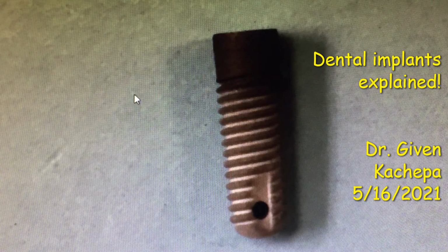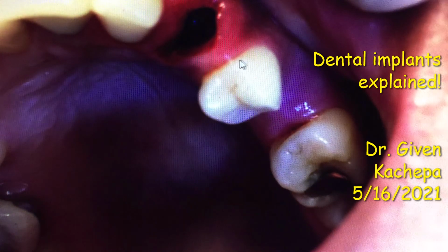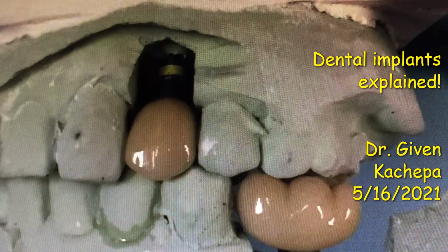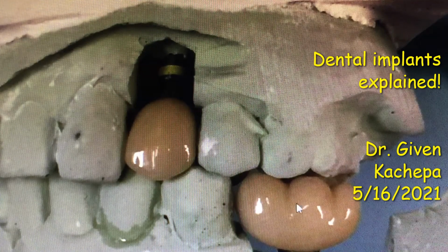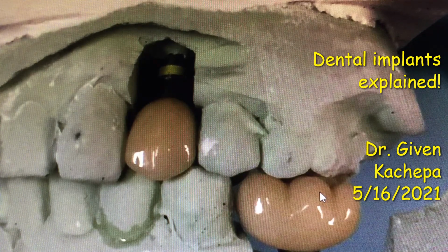So anyways, dental implants are just prostheses like this that we put in osteotomies like that there. And the patient comes back later and we make crowns that look like this, and the patient can smile and everything, and you pick the shade and color and they look good in a lot of the cases. So if you need one, give us a call here at Inwood Dental.